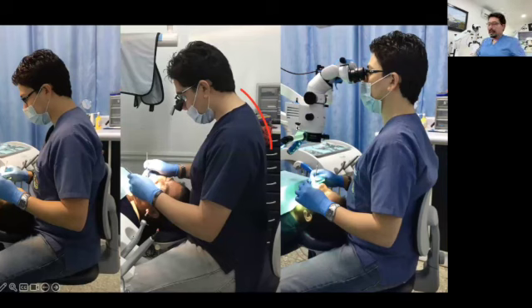And we can analyze something interesting in this picture, because before working with the microscope, I started working with loupes. But if you analyze the position of my neck, those loupes were killing my neck. The position was even better without using the loupes.